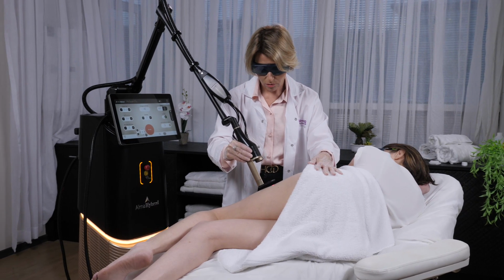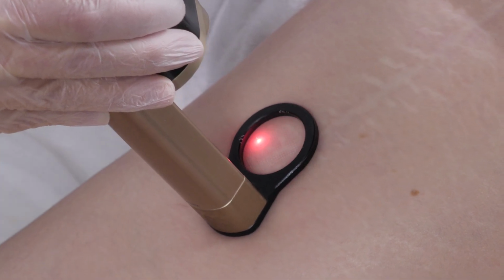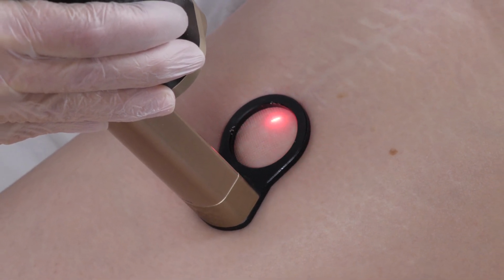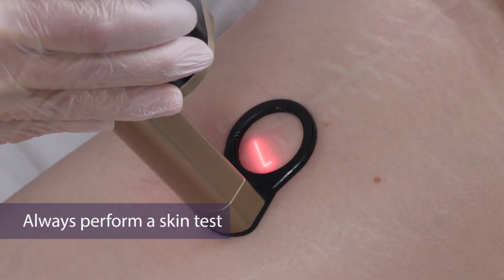Place the applicator perpendicular to the skin and press on the foot switch to emit laser. Work in a stamping method. For ideal coverage, space the scanning areas next to each other with no overlap. Always perform a skin test.